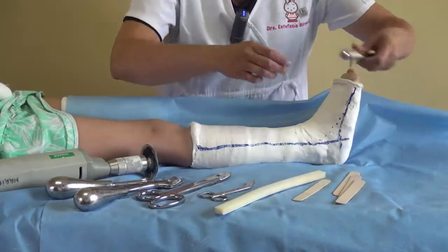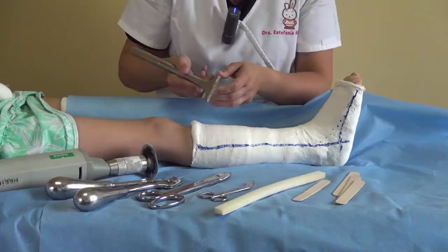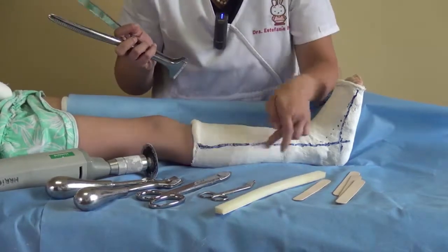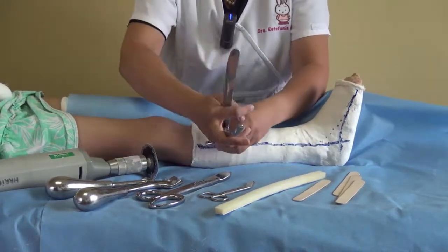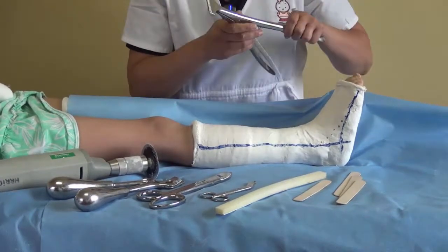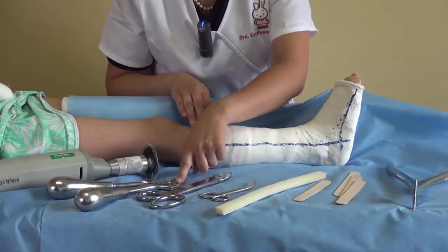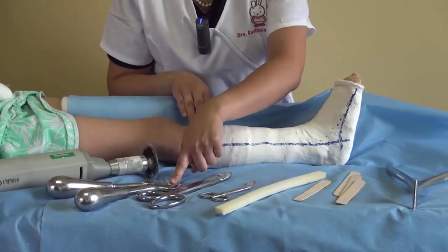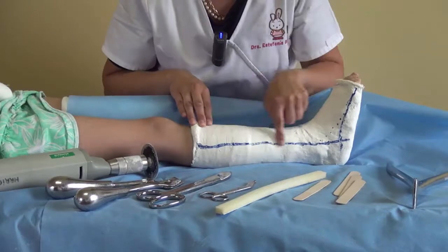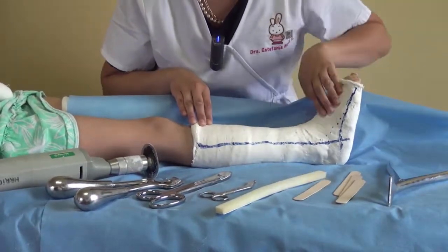We also use this as a spreader. You make the initial cut and then you spread or separate the cast with this one. You can follow the line with the cast cutter or the saw and then put this other apparatus.